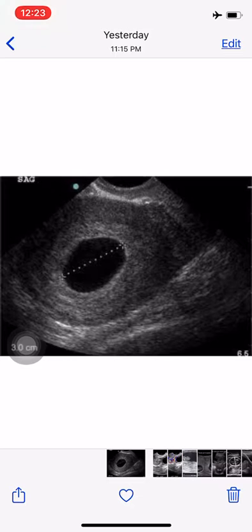Few points about the role of ultrasound in the first trimester. أولا, detection of non-viable pregnancy, يعني differentiation between viable pregnancy and non-viable pregnancy. Non-viable pregnancy لها many causes. ممكن يكون blighted ovum, يعني gestational sac without fetus, without fetal pole, أو ممكن missed abortion، أو ممكن incomplete abortion، أو intrauterine death. فهذه كلها ممكن نشوفها وأن can be diagnosed by ultrasound in the first trimester.